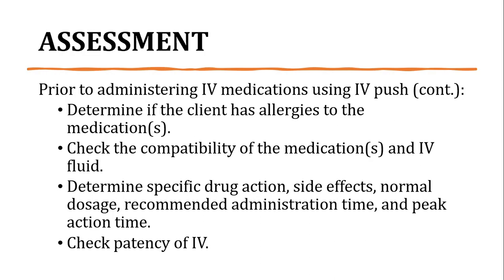vessel ng client. Kapag po, for example, sa existing line, kapag po in-clamp yung infusion o yung IV tubing, tapos ni-administer na yung medication, which is, for example, that medication is not compatible with the IV fluid na nakalagay sa existing line ng client.